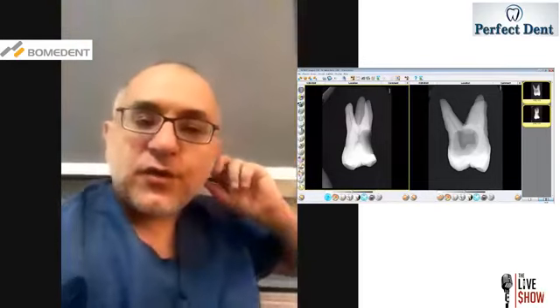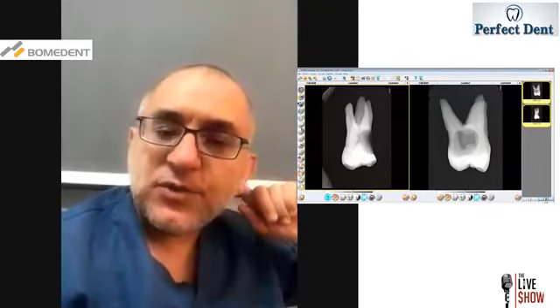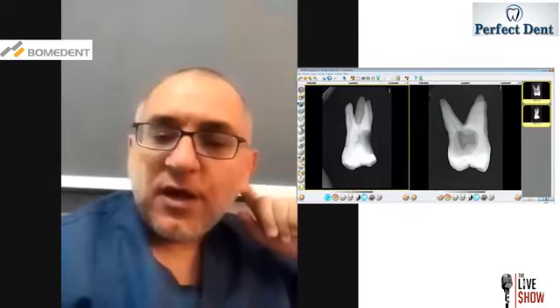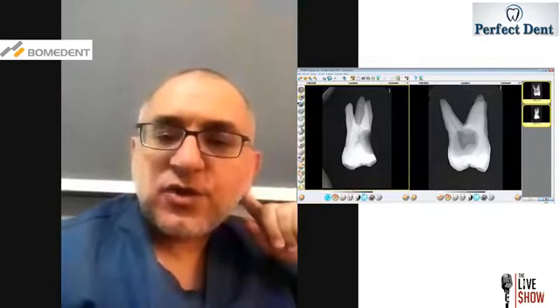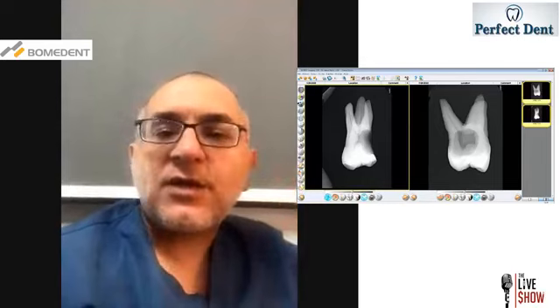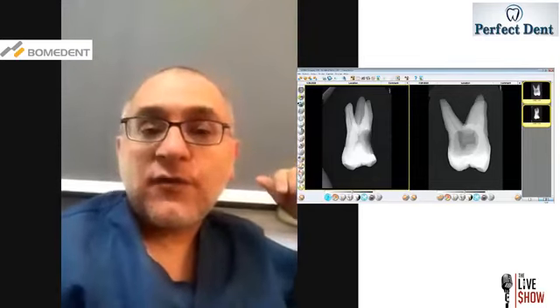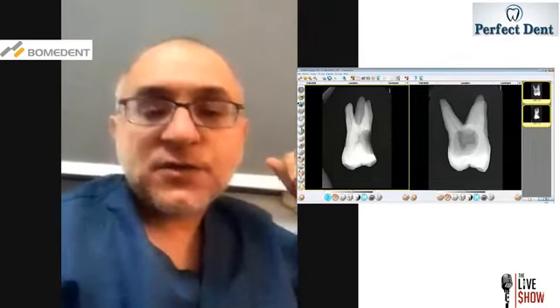I don't know if you saw the video when I first started. The video was of an access cavity which I opened up using a round burr and then an endo Z burr. The ultrasonics are used to clean the areas which are overhanging, without the necessity to remove the overlying tooth structure of enamel and dentine and losing all that tooth structure. So you can go back, look at the video, and you see how I refined the access cavity with the ultrasonics. Or if you have a more specific question, I can answer.